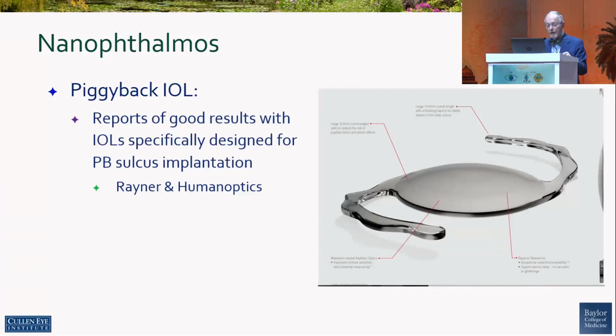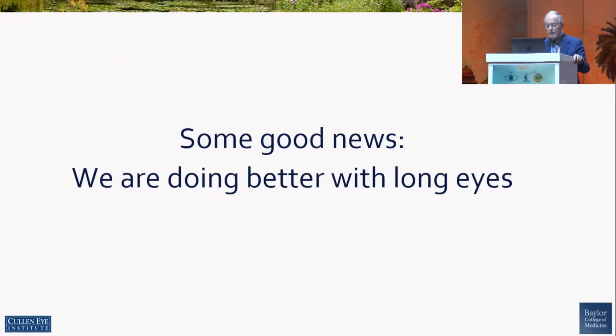And piggyback IOLs, I actually learned this from colleagues here in India. You have access to these wonderful add-on lenses that I think this is the one time in a short eye one could probably use a piggyback IOL, but I'd like to hear people's experience with that.